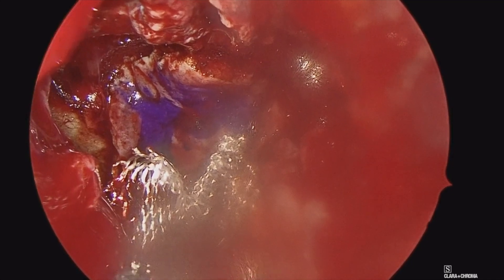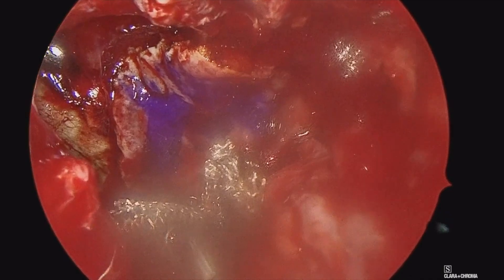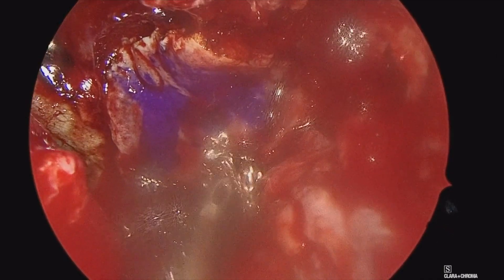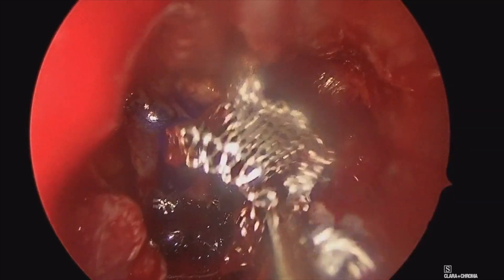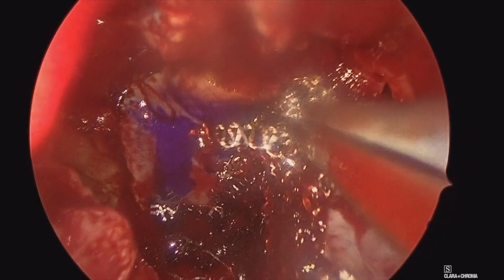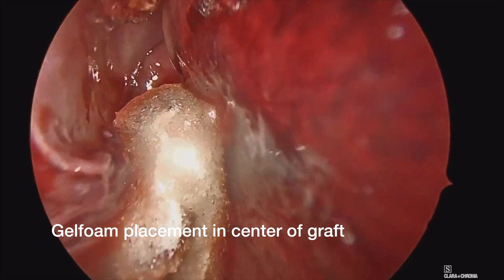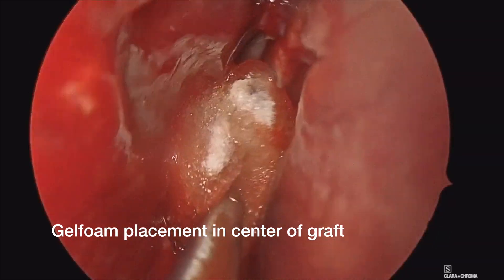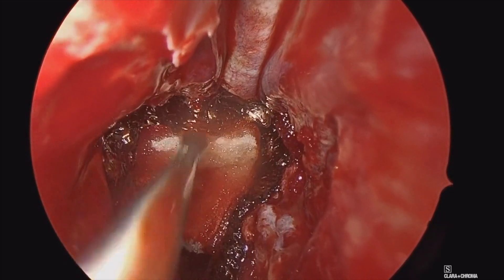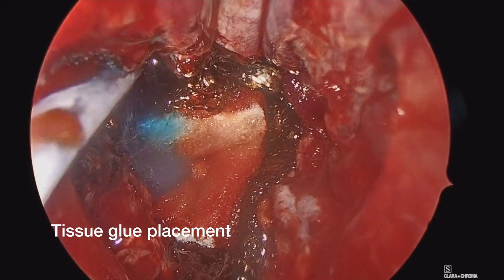Here we are placing some Surgicel in a picture frame fashion around the edges, as you can see here, to stick that edge of the graft down to the exposed bone circumferentially 360 degrees around the defect. After the Surgicel is placed, I tend to put one piece of gel foam directly in the middle of the graft to have a nice apposition and a little bit of pressure. And then I tend to use tissue glue, as you can see here, to come in and glue down the edges of the graft as well.